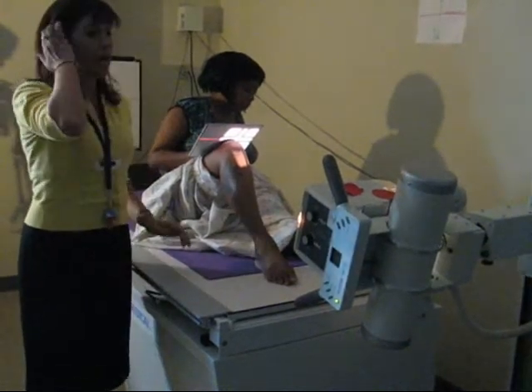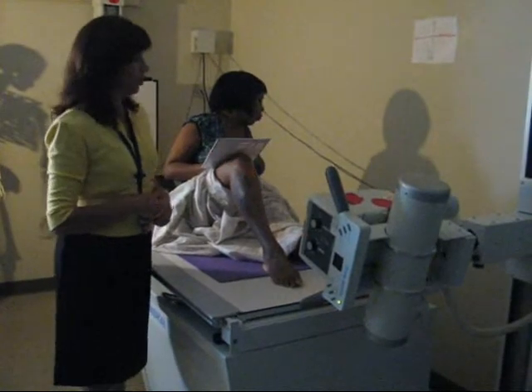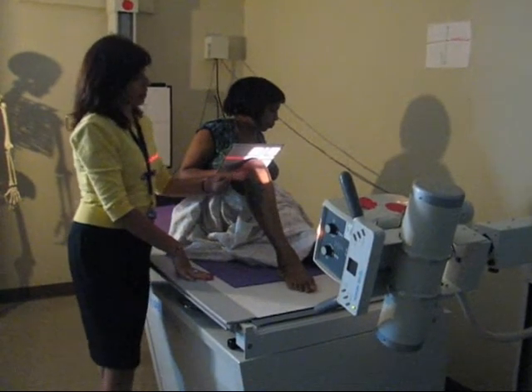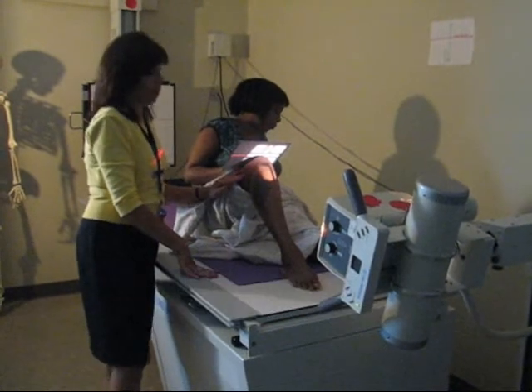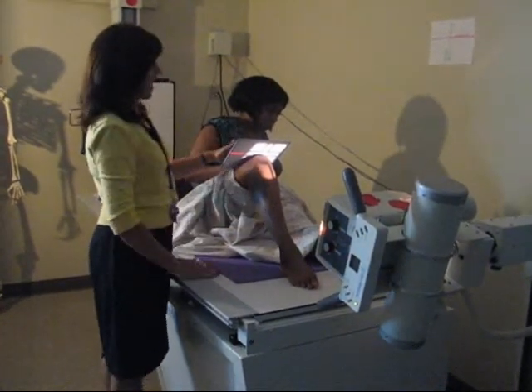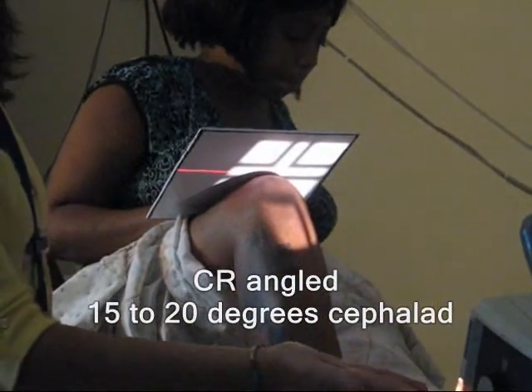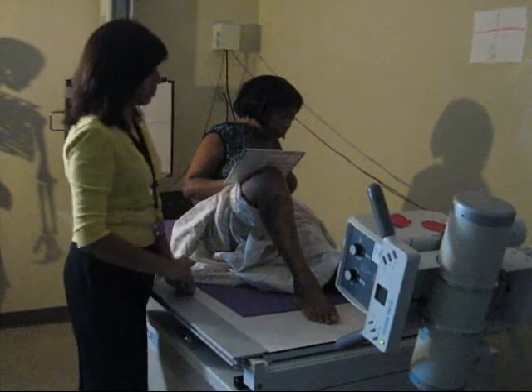So it depends on how your X-ray room is built, whether or not you're going to be able to do this. Still, your knee is bent at about a 90 degree angle between the femur and the tib-fib. The patient is actually the one holding the cassette, and you have about a 15 to 20 degree angulation on the tube, cephalad towards the head.